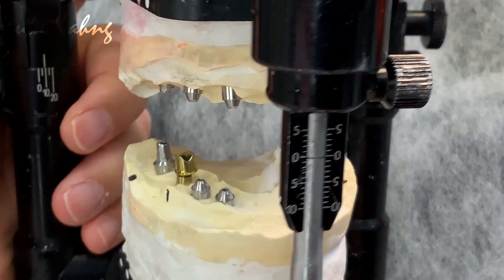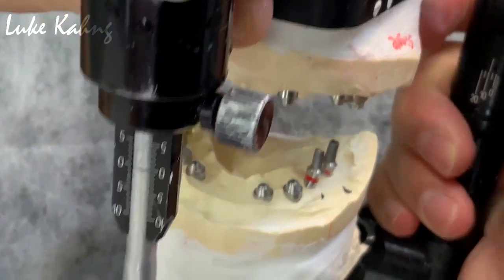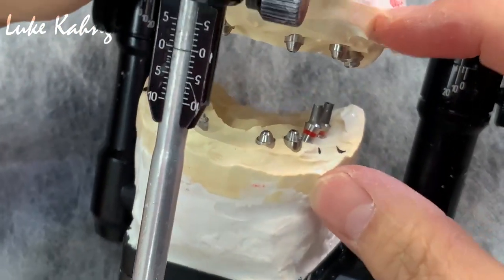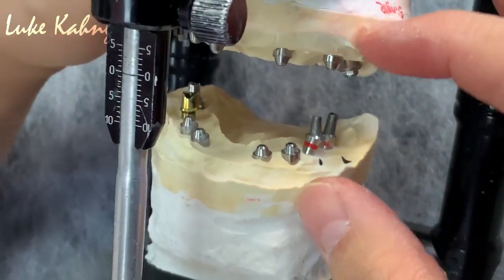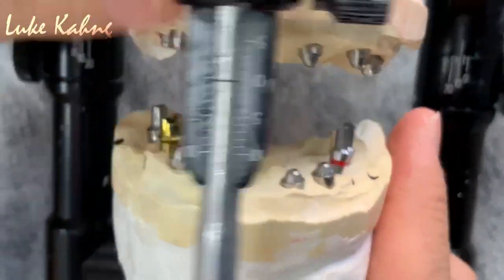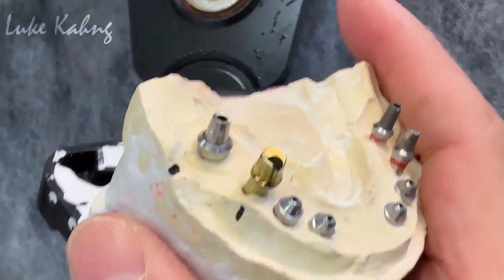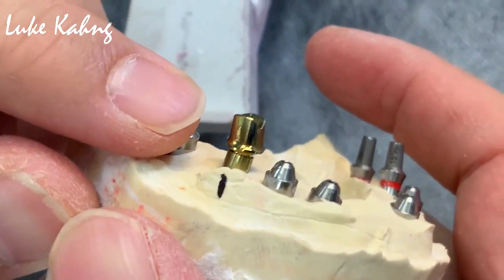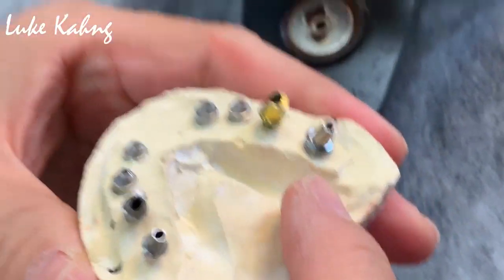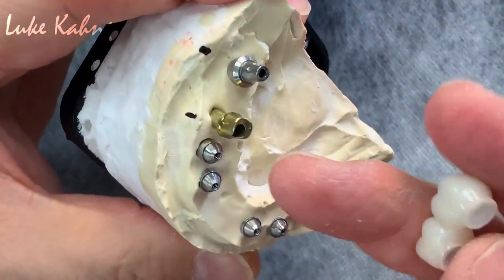Finally, doctor's mounting — that is with the Artex articulator, which is great. The vertical setup with his wax try-in. We made good custom abutments with this. We anodize it and polish it, and anodize it.